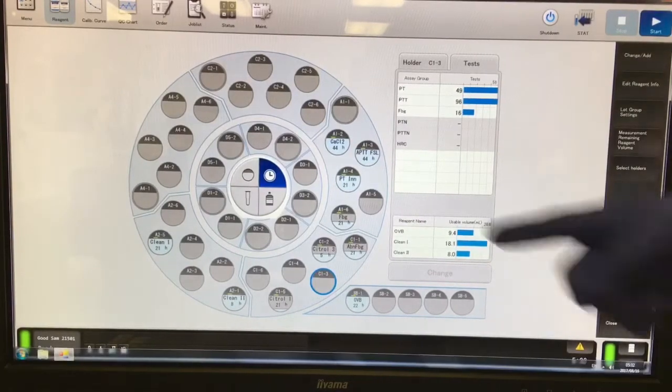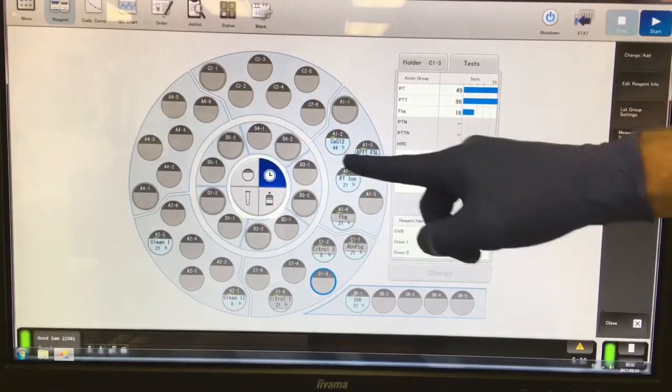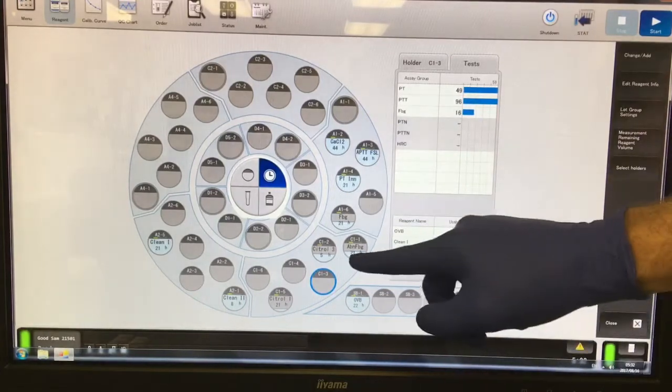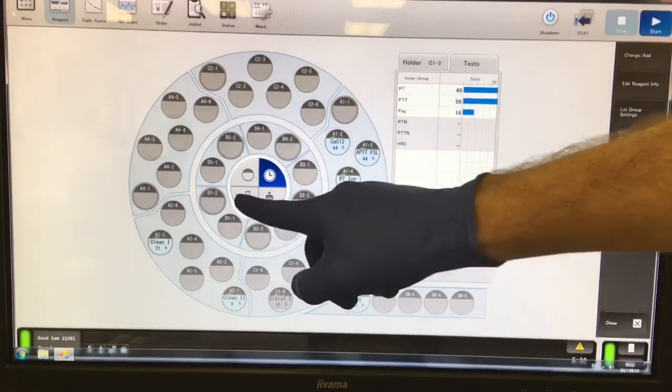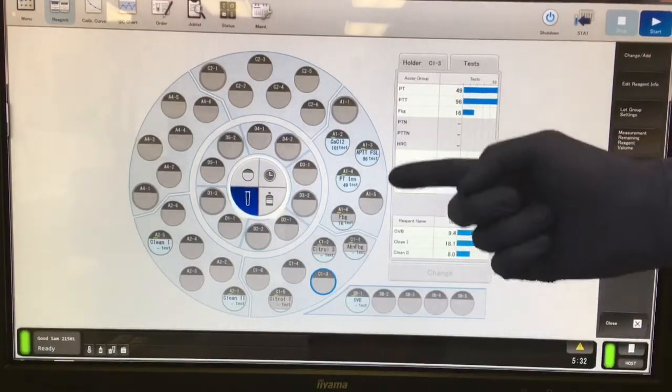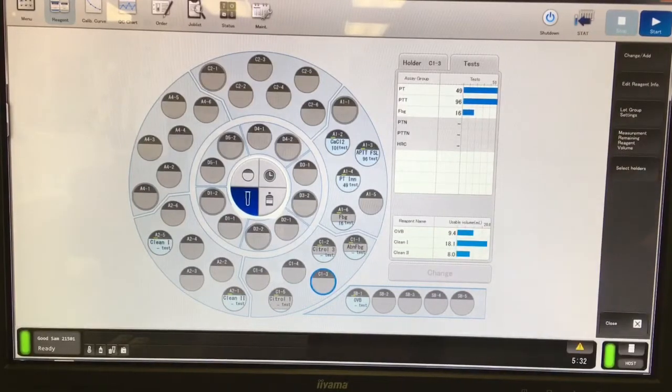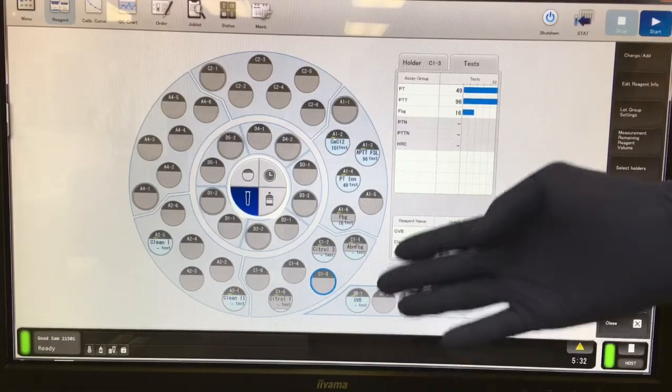The screen shows you all of the reagents and QC you have internal to your analyzer currently on racks. You can select a variety of different information settings from here, the time things have been on the analyzer, and the amount of tests still available.